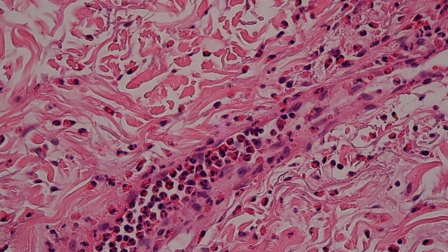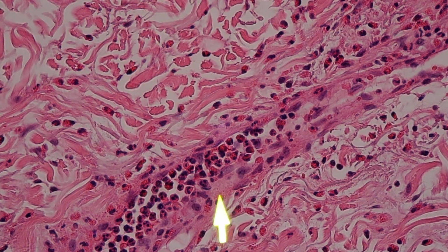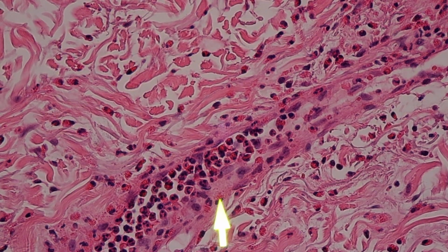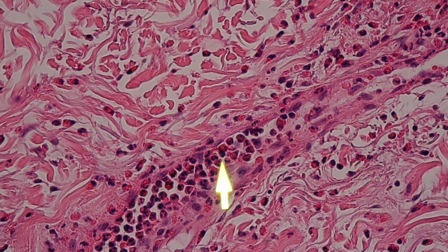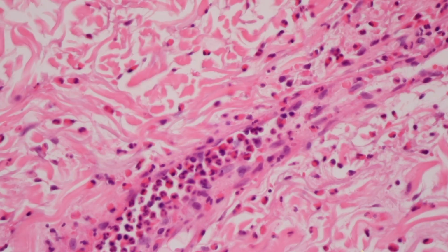Let's turn the light up a little bit. You can pick up these guys down here. Look at all those little granules and little aviator sunglasses there. Those are your eosinophils. And you can see that those guys I was pointing at there, they don't have those granules. So that's how you can tell eosinophils and neutrophils apart. And also sometimes lymphocytes or neutrophils sitting on top of a red blood cell in the section can look like an eosinophil. So those things are there to keep our life interesting while we're trying to look around microscopically and figure out what the cells are.